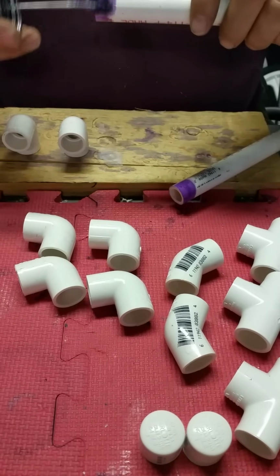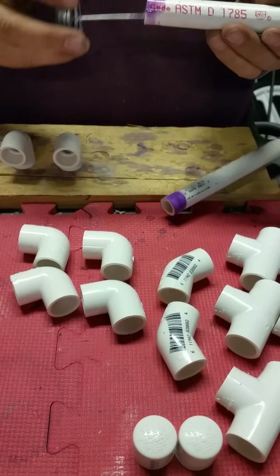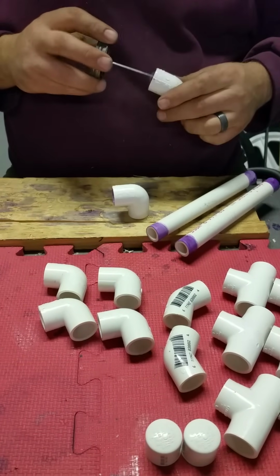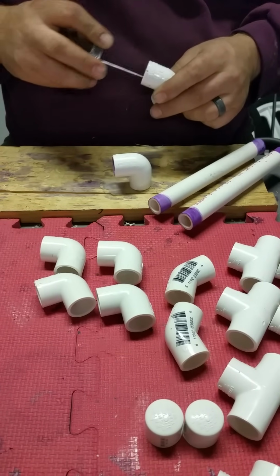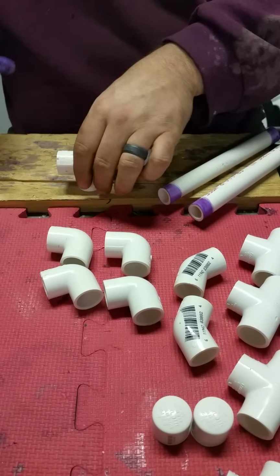Don't prime too many pieces before you're ready to use them. You want to try and avoid drips and drops. It'll make your cart look neater and also prevent joints that you don't want glued yet from getting glue in them.